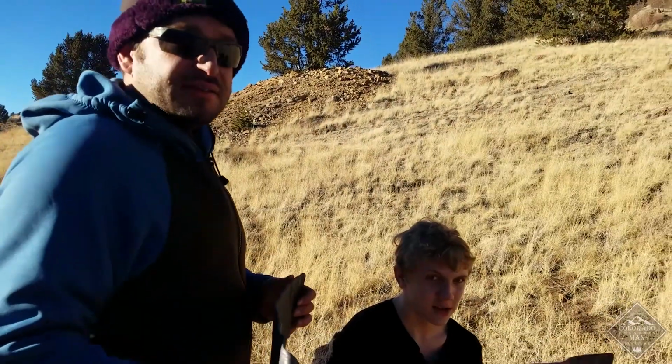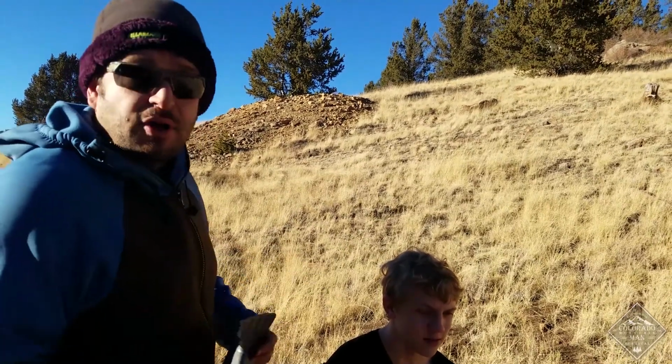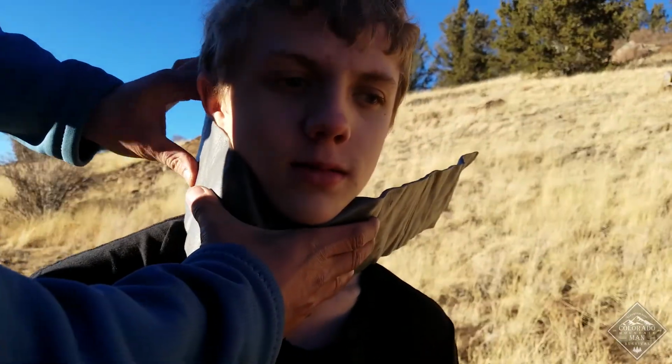All right, so he's got his head in position. I've either instructed him to sit like that, or I've got somebody holding C-spine. So I'm going to come under his jaw. That's going to be what holds his head right there.